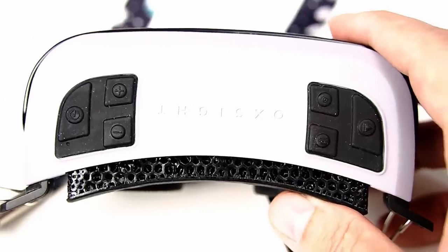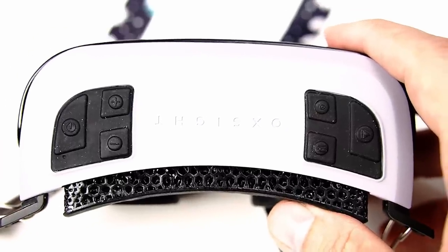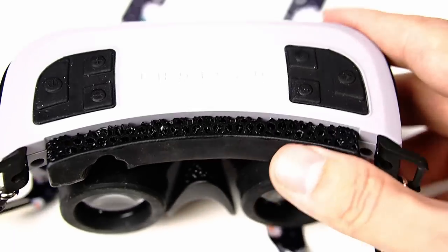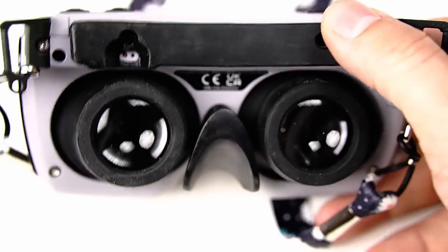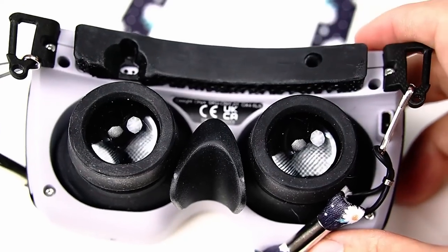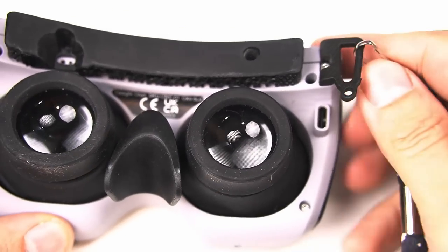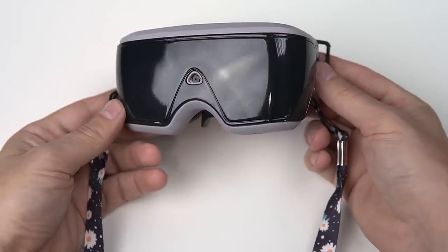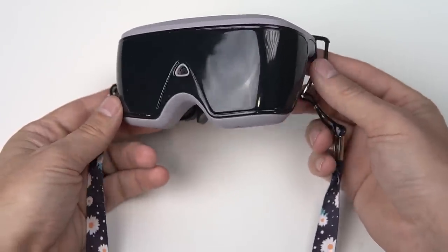You have six buttons on the top and they are very tactile — it's easy to feel the difference between them. You also have the ability to adjust the eye cup width; these eye cups slide left and right. There are little brackets on the side to connect the head strap and lanyard. It has a USB Type-C charging port on the right side. The camera is on the front in the center, and there are some LEDs that show up when you're charging.